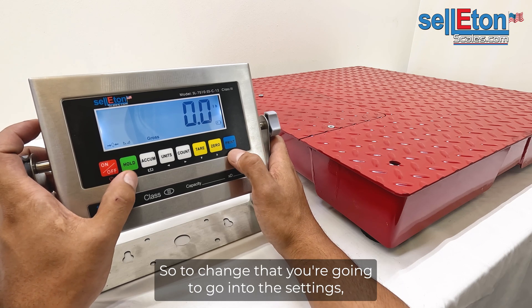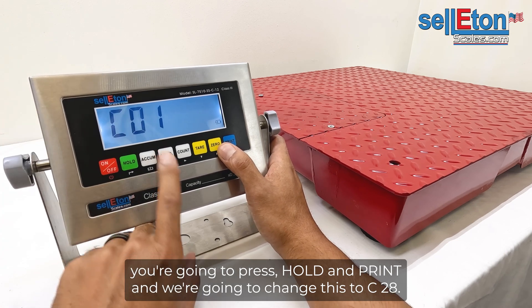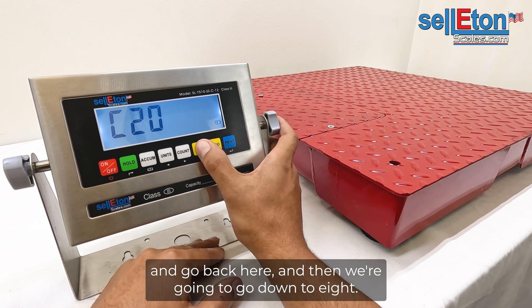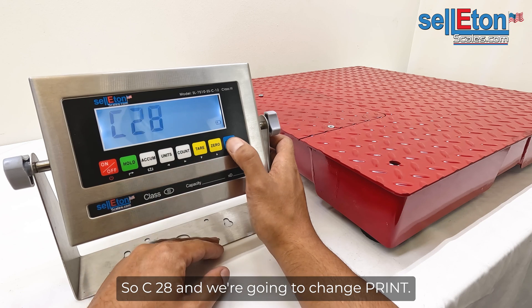To change that, you're going to go into the settings — press hold and print — and we're going to change this to C28. So we're going to go left, go up two times to two, go back, and then go down to eight. So C28, and we're going to change print.